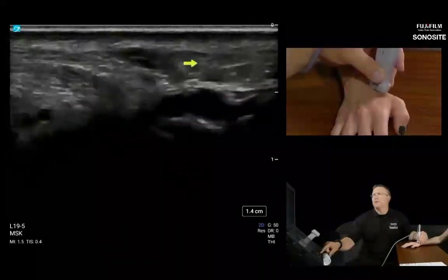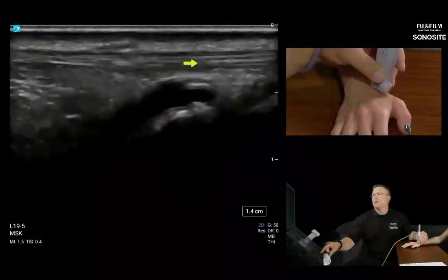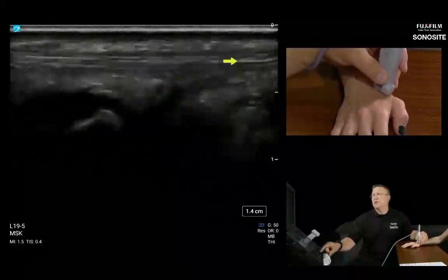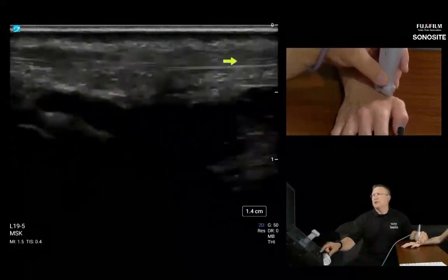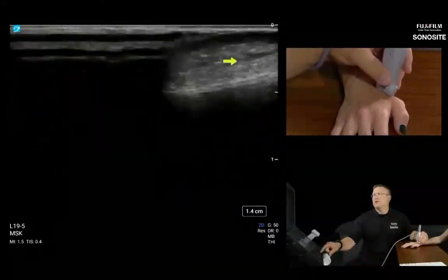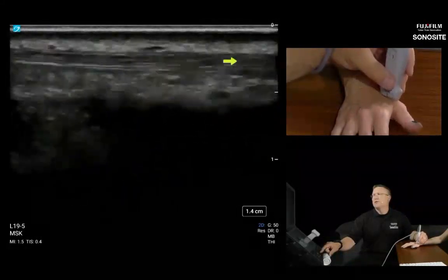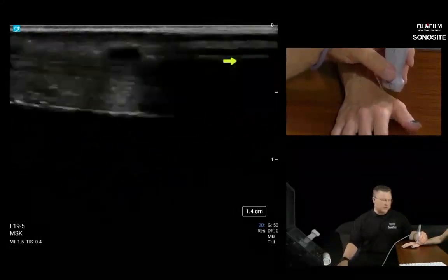There. It's a very skinny tendon. It can be hard to follow, but at 19 megahertz with a small footprint linear, it is much easier to follow than with a larger linear, and you can really trace these tendons down to whatever might be the culprit.